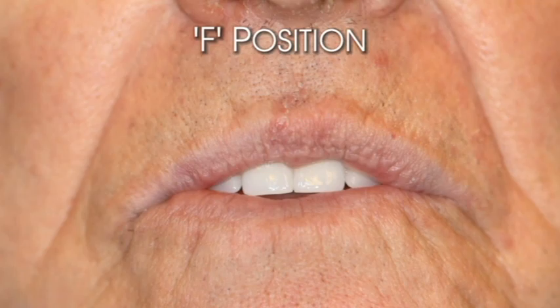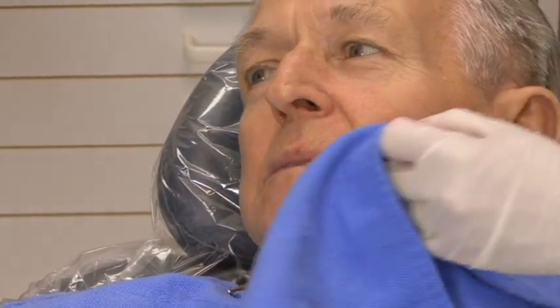Say 55 for me now. 55. Look up at Dennis and say 55. 55. 66. 66. He can say 66 without his teeth. Raise your lip up as high as you can. As you can see, he shows just a little bit of pink across the top. Let's check his midline. Mighty good.